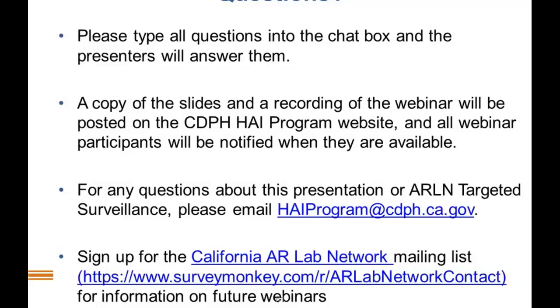I know you talked a little bit about the algorithm of where things are tested and when. From the time we receive the isolate, what is the anticipated turnaround time for any sort of carbapenemase testing, whether molecular or phenotypic? Right. Again, this will depend on the type of testing that needs to be done. Of course, we do identification, verification on all isolates that are received. If molecular testing has not been performed, that will be performed first.